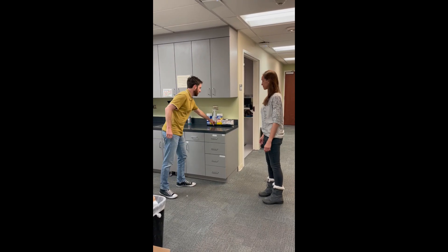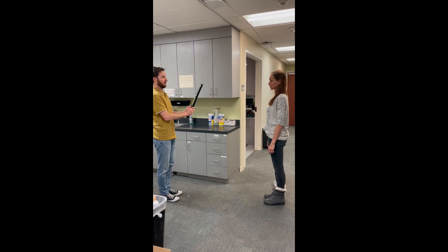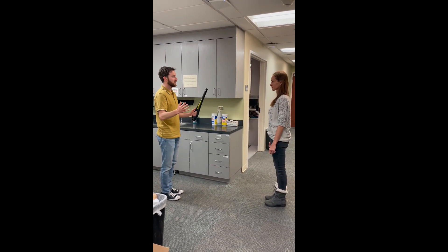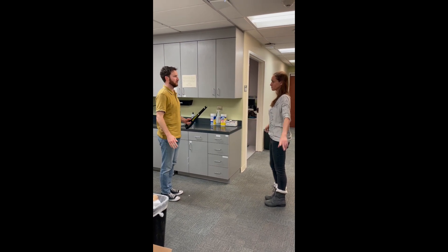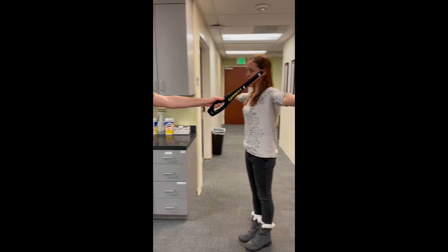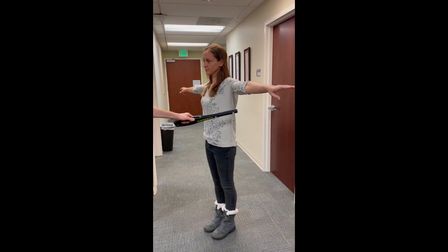The next procedure is we're going to scan you with our metal wand, our metal detector. I'm going to go ahead and turn this on, and when it detects metal it's going to beep. If you could please open up your arms, I'm going to scan around your person to see if I can detect anything that might be in your pockets.